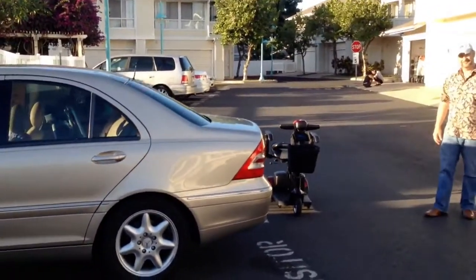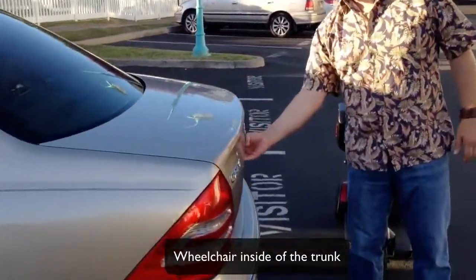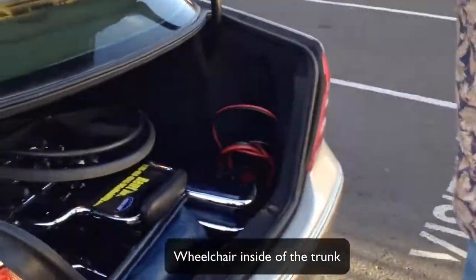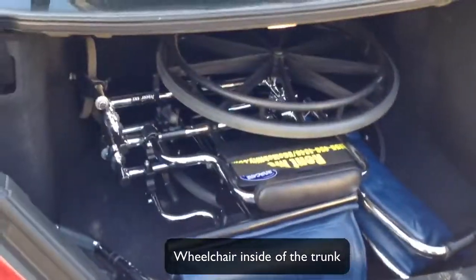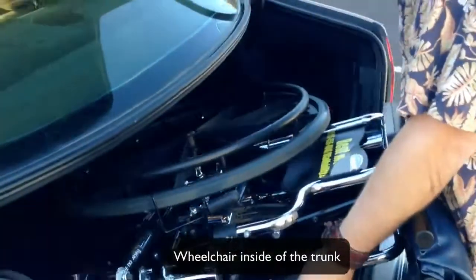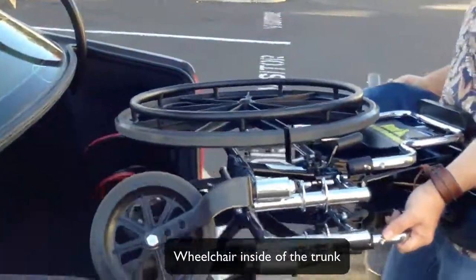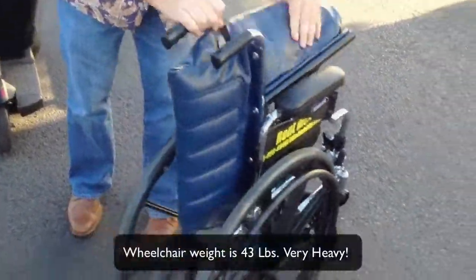Let's take a look at the trunk and how things fit. So what is in here? It's a manual wheelchair. Looks like it's fitting in there pretty well. Of course, there's no luggage in there or anything like that, but this is just to show the difference between a manual wheelchair and a mobility scooter. 43 pounds all at one time — that's somewhat heavy.